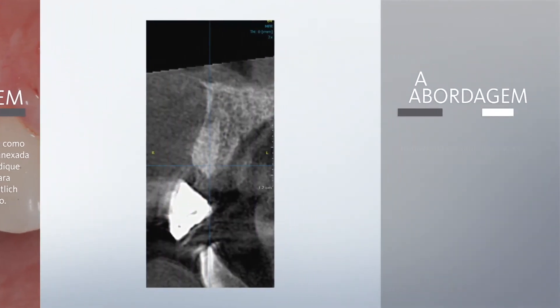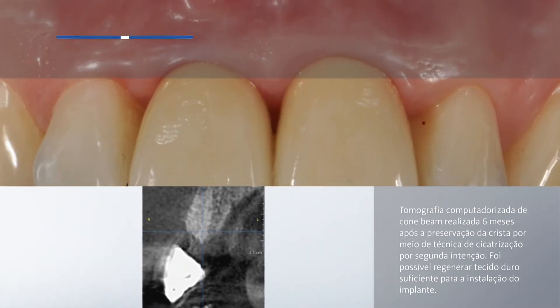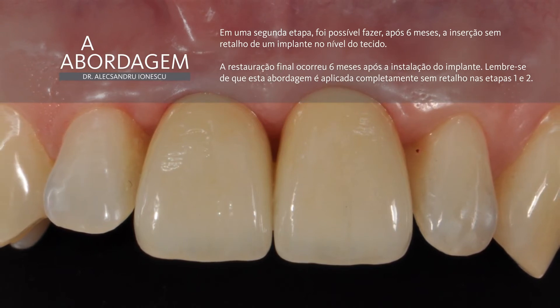The CBCT scan after 6 months confirmed the favorable clinical outcome for flapless implant placement. This is the clinical outcome after the crown was cemented on the implant, respecting the biological width prosthetic protocol.